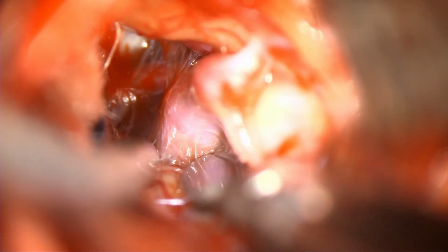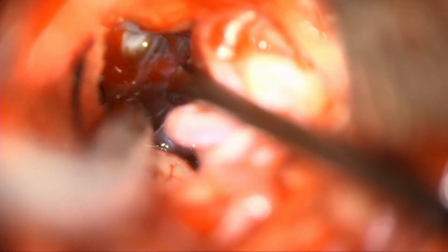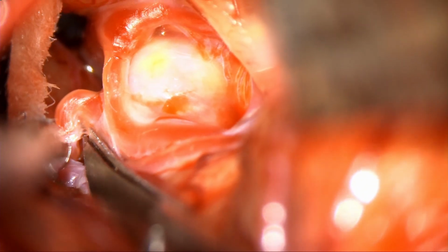Sharp dissection is performed around these arachnoidal adhesions to obtain proximal control. Dissection is completed around this main anterior temporal artery going into the proximal middle cerebral artery.